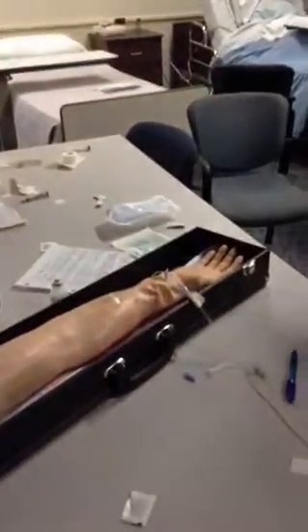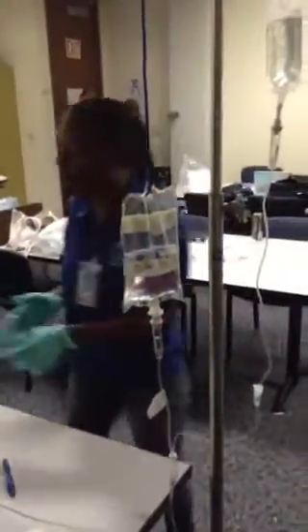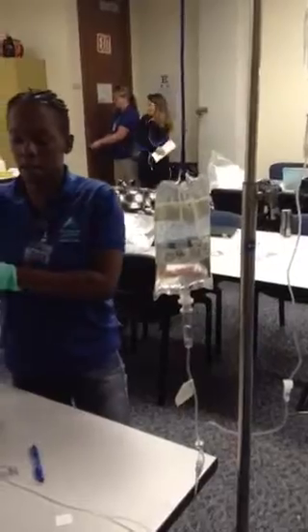Leave that there — it'll go over an hour. I'll take my gloves off. Once I come back, I would wash my hands and apply my gloves again.